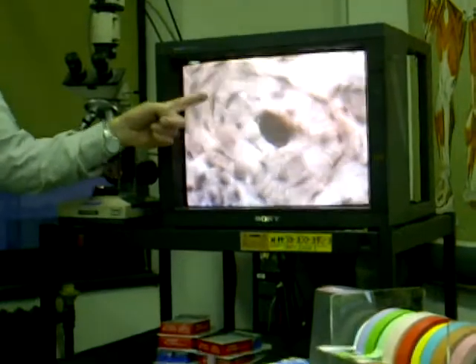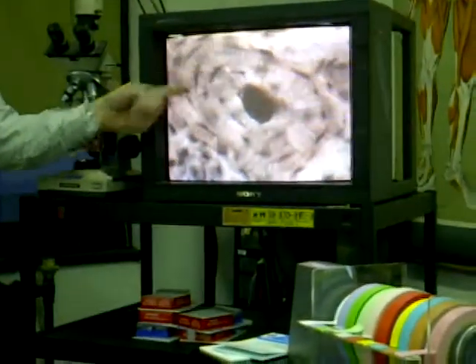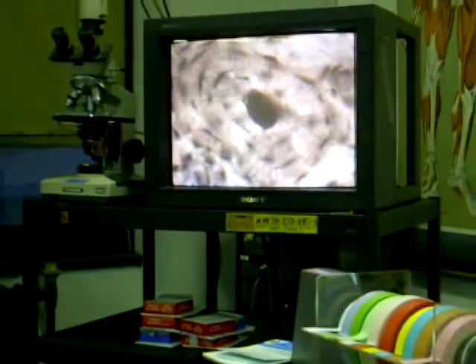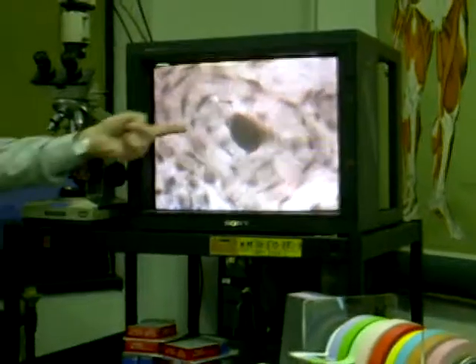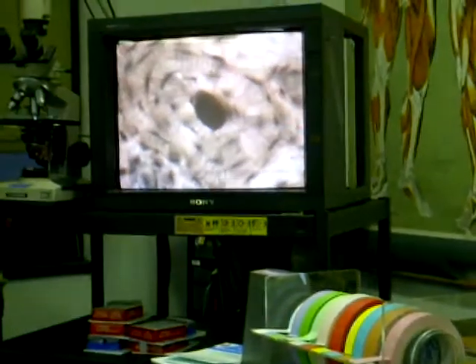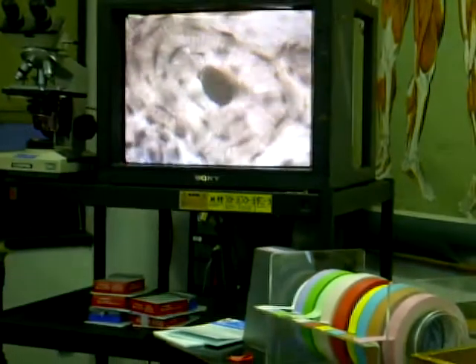And these black spaces are called lacunae, and in each one lived a cell, and the cell that used to live there is called an osteocyte. And these canaliculi were also filled with the osteocytes' dendritic projections.